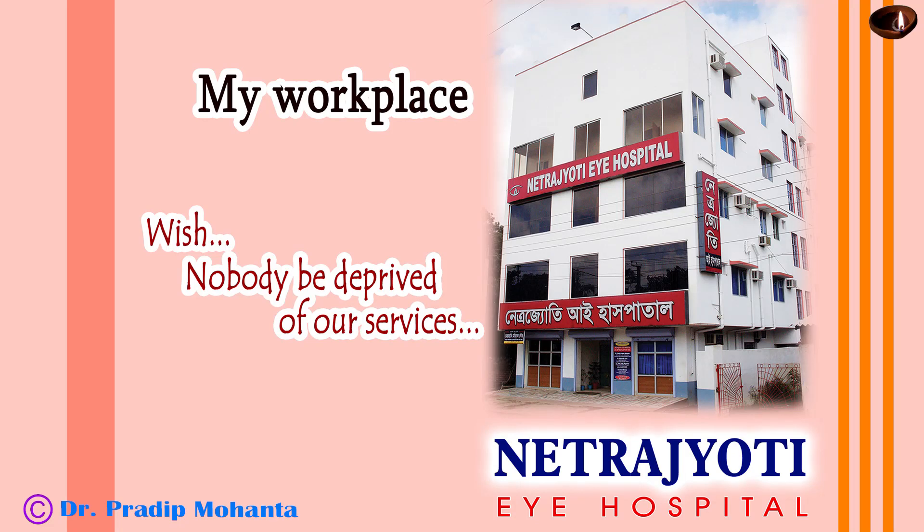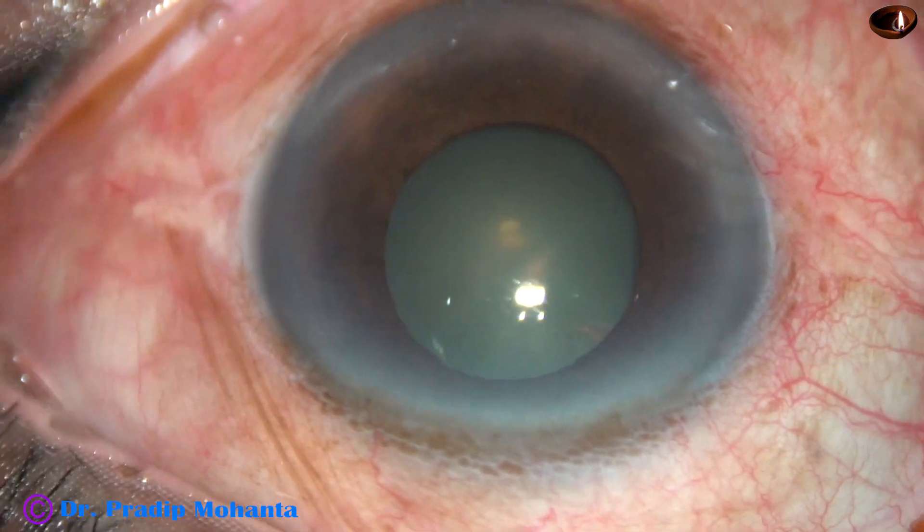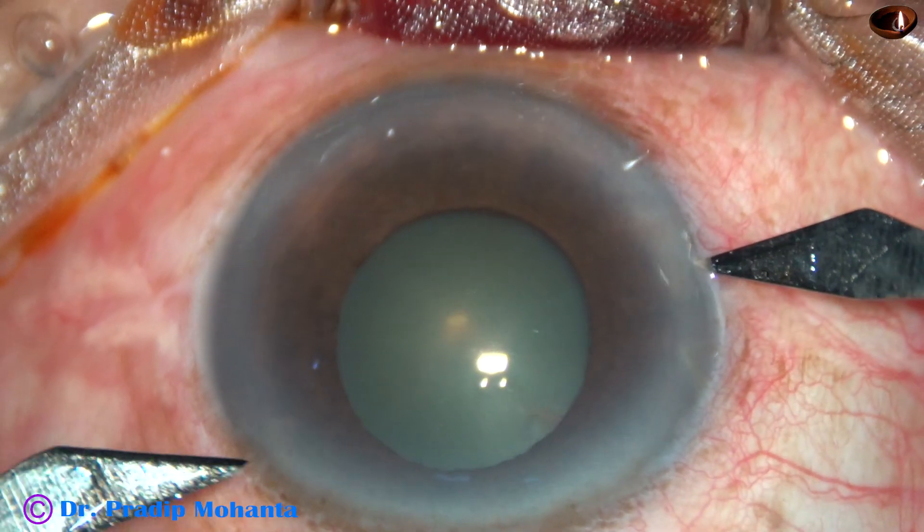Friends, welcome to my workplace at Ranaghat, West Bengal, India. This is a cataract with small pupil. Let us observe the surgical steps.